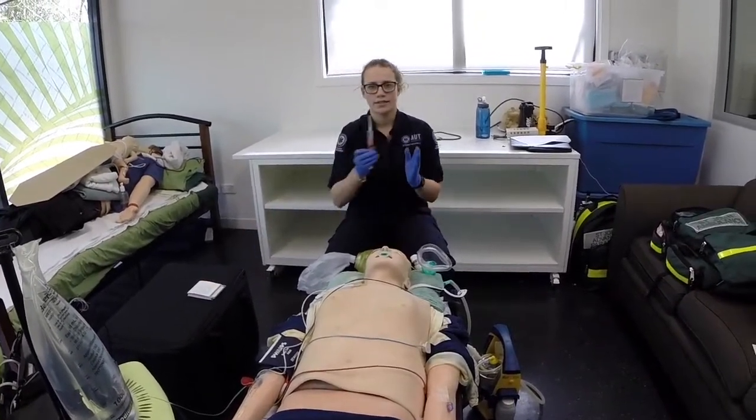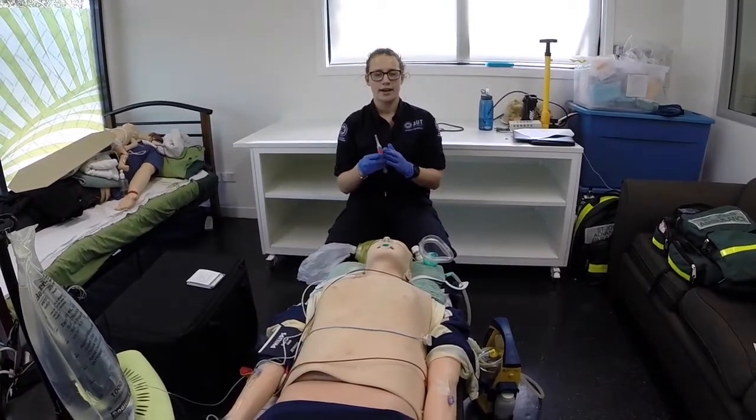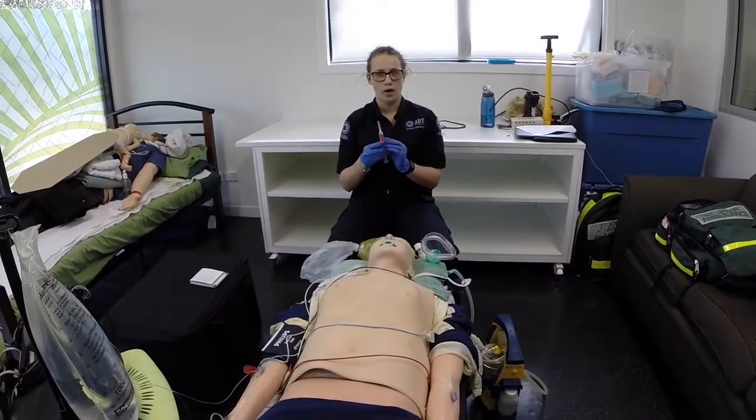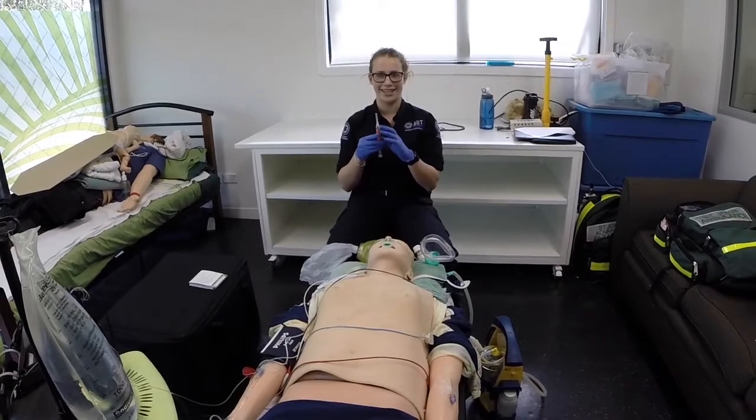We have also got some morphine drawn up. So this is a 10 mg in 1 ml IV with 9 ml of sodium chloride solution together.